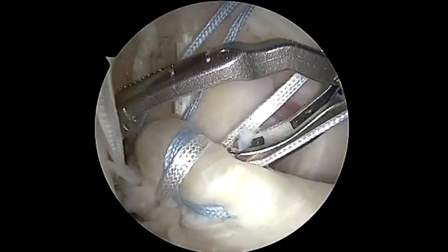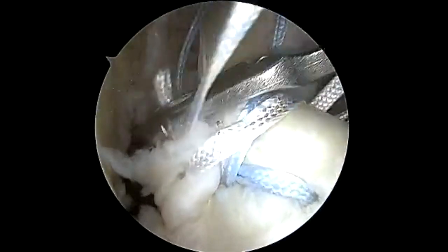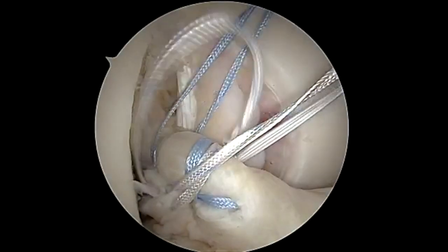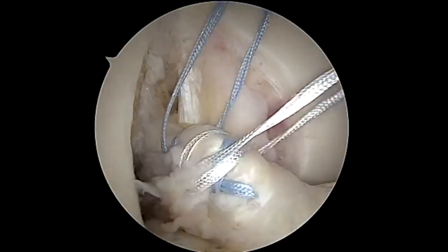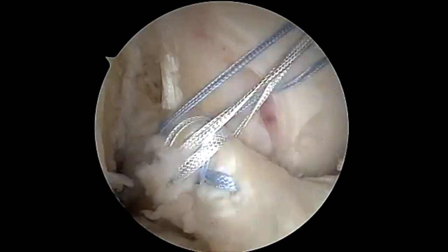Similarly, the suturing of the posterolateral bundle is performed using a suture passer and No. 2 FiberWire in the same fashion. Sutures are retrieved through the accessory portals accordingly.